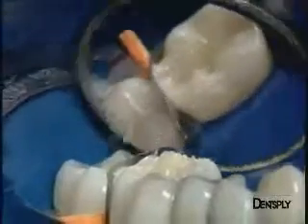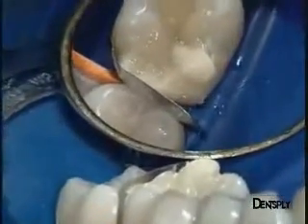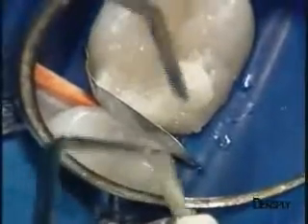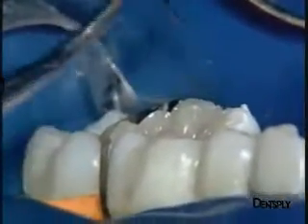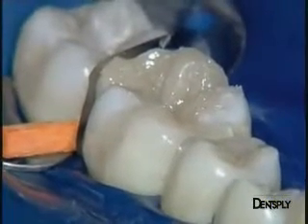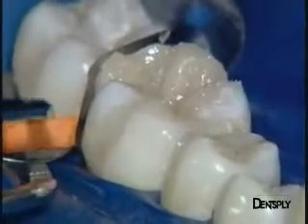The paladent matrix is moved away so that we can clearly see the line between the lingual and proximal faces. Small additional layers are placed in order to achieve this type of finish. It's already evident that the occlusal anatomical configuration is well done, and the matrix can be withdrawn.